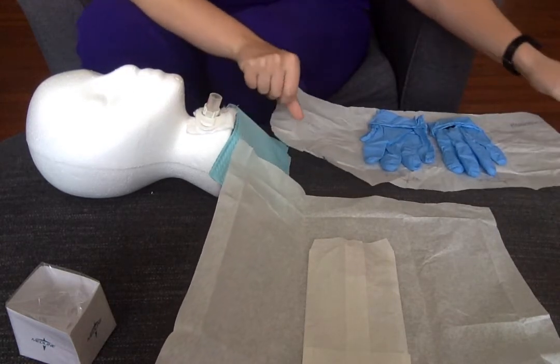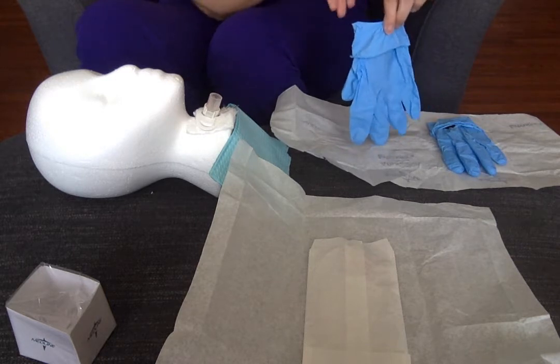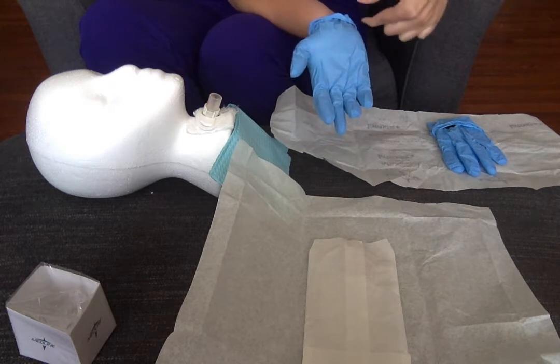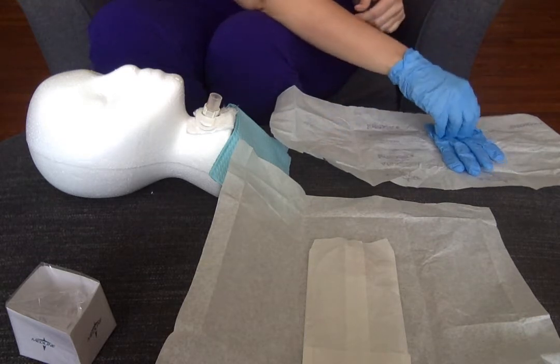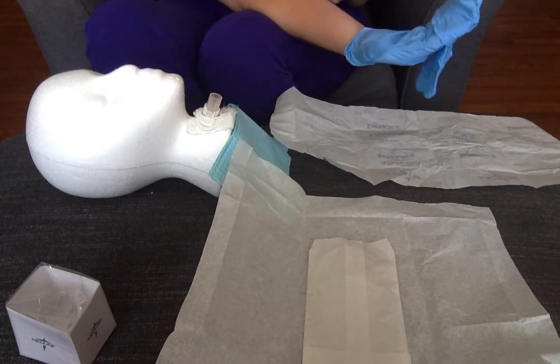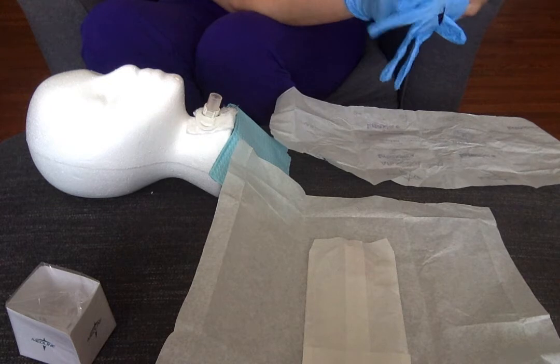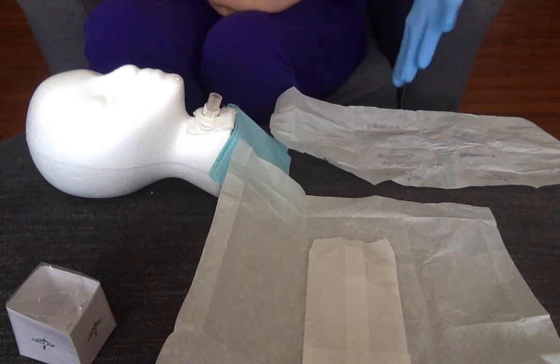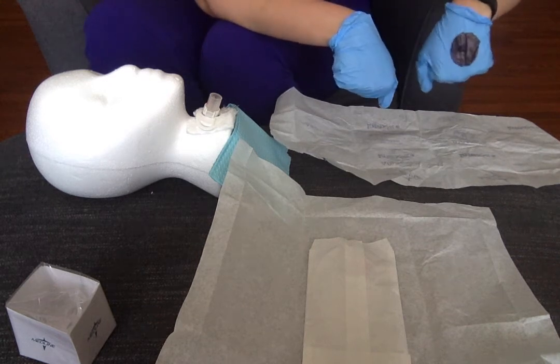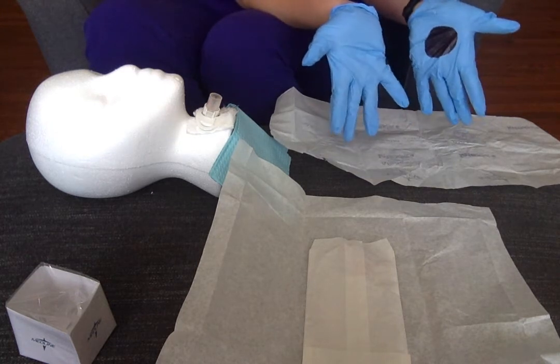You can touch the cuff because it will be touching the inside of your arm, so it's not considered sterile. The glove is set up to go on this way, so go ahead and put the sterile glove on. Don't reach back and grab the outside part of the cuff to unroll it — just leave it. For the second glove, sterile can touch sterile, so slide your fingers under the cuff keeping your thumb away, as the inside part will touch the inside of your hand. My right hand will stay sterile and my left hand will be my dirty hand.